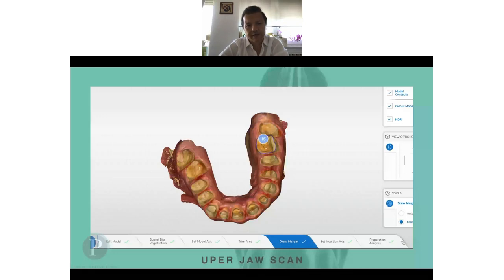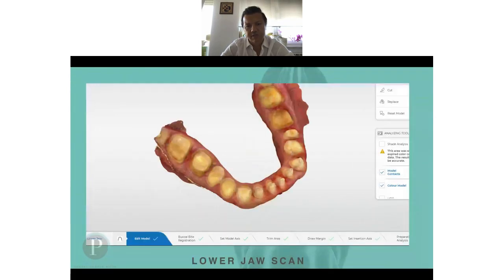If you see further on tooth 14, it has a very strange look. The oral surface was almost untouched in my preparation, because this is a mechanical tooth wear on this point. I didn't use any burr on this surface of this tooth. I'm mentioning this because it is what I mean when I say it has to be morphology driven. We can just stick to this idea and preserve as much tooth as possible.